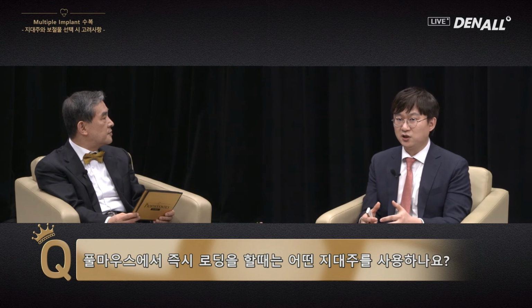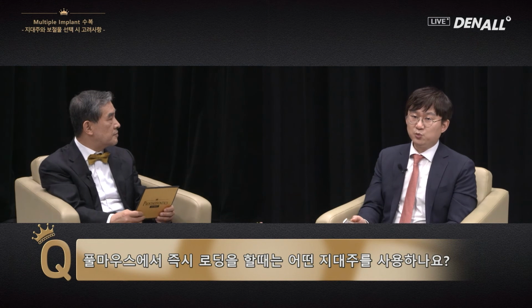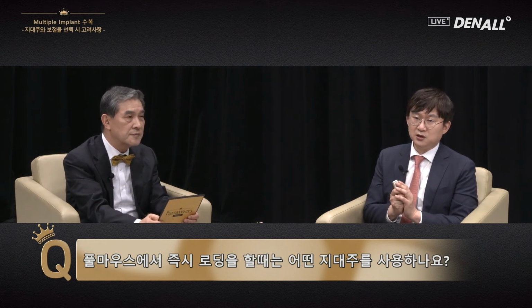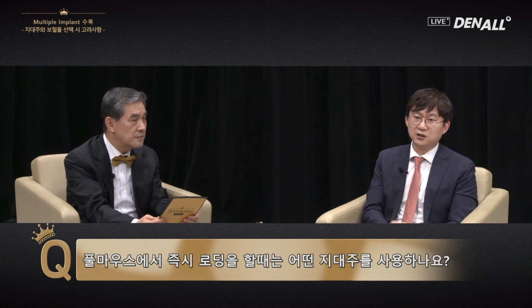For the full mouth, in the past, I used guided surgery. Implant positions are determined, and abutments and crowns can be fabricated together, but this is sectioned and splinted later. This is a comfortable procedure, but sometimes I'm concerned the cementation can fail and the prosthesis can fall off.